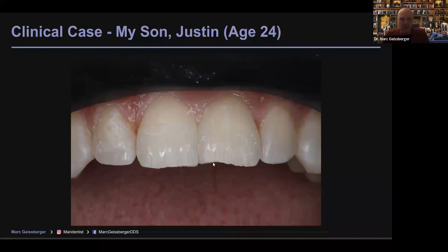Okay, so with that said, if you notice, I've come across here and I've just very lightly modified the surface topography here and modified it here. And it's irregular. It's not so structured. So some are extremely close together. Then I go a little distance. These three are very close together. Then I leave that area smooth. These two are close together and I jump and do another one here. Then we place our irregular bevel across the enamel, okay?